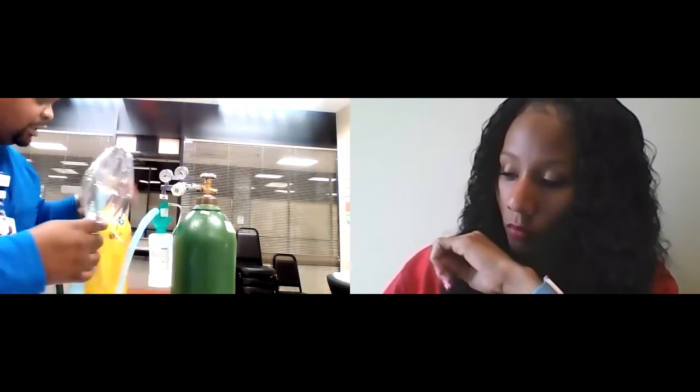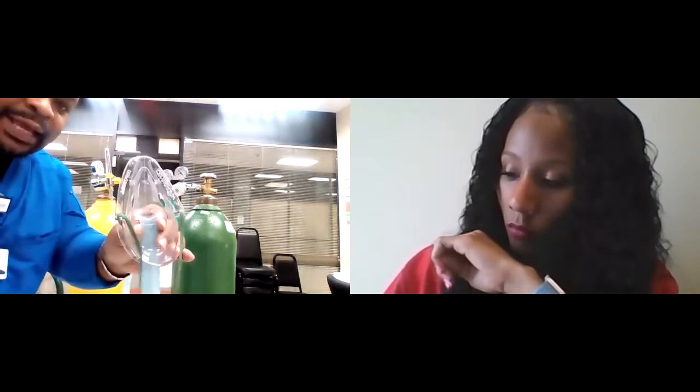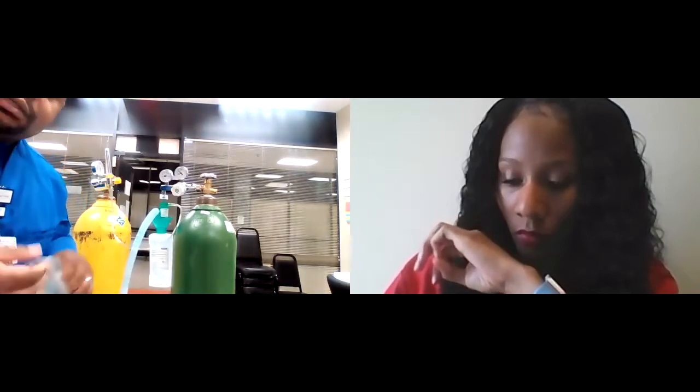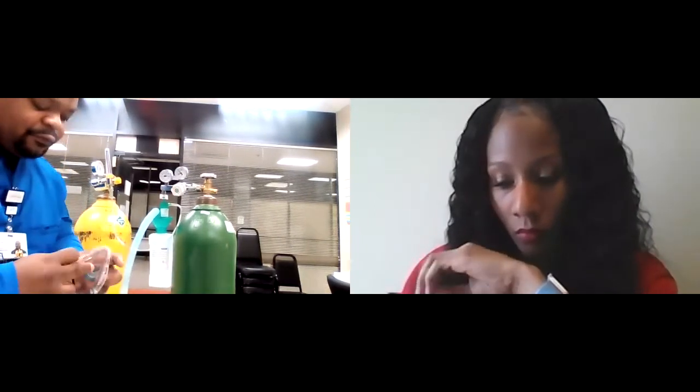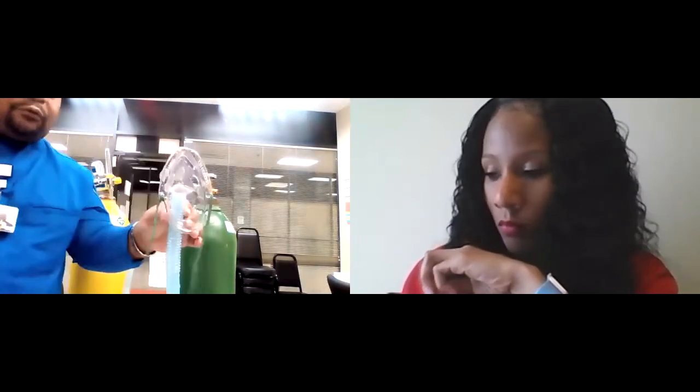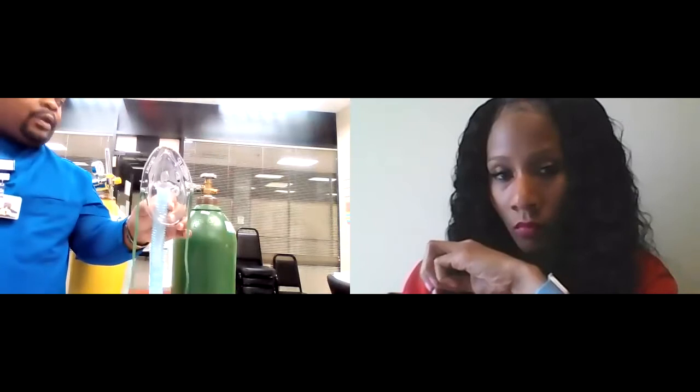Now, all of that is coming to this one mask. I need to know how much is the FiO2? How much is he actually getting? I can't just guess. I have to know, because if he's a COPD patient, I need to be very, very careful, right? So how do I chart how much FiO2 is coming out of here? I have to use the formula. All right, so I'm gonna let you look at this for a minute, and then we're gonna go to the board and work it out.